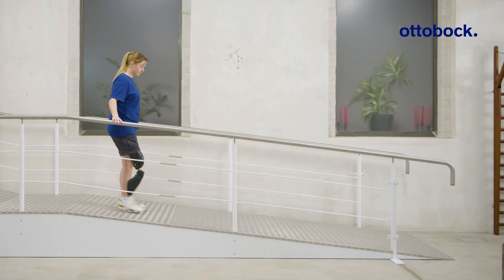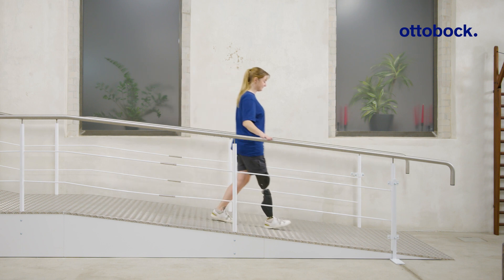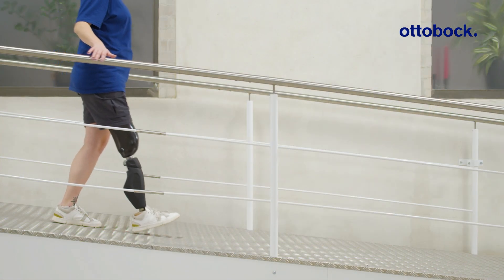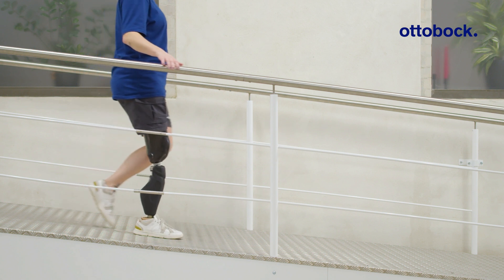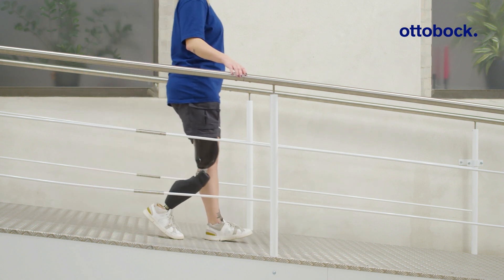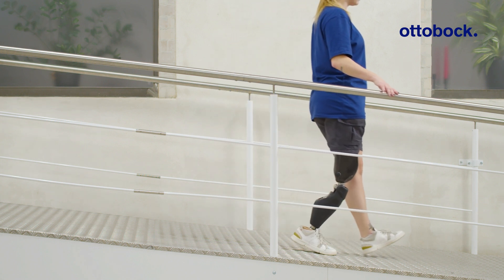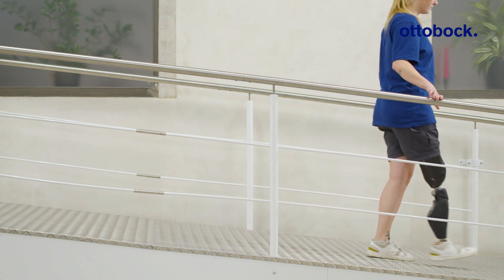Early stance phase support increases flexion resistance early in stance phase. The selected level defines the additional support from heel strike to mid stance. It enables more controlled stance phase flexion, as well as slower and more controlled walking on shallow to medium ramps.